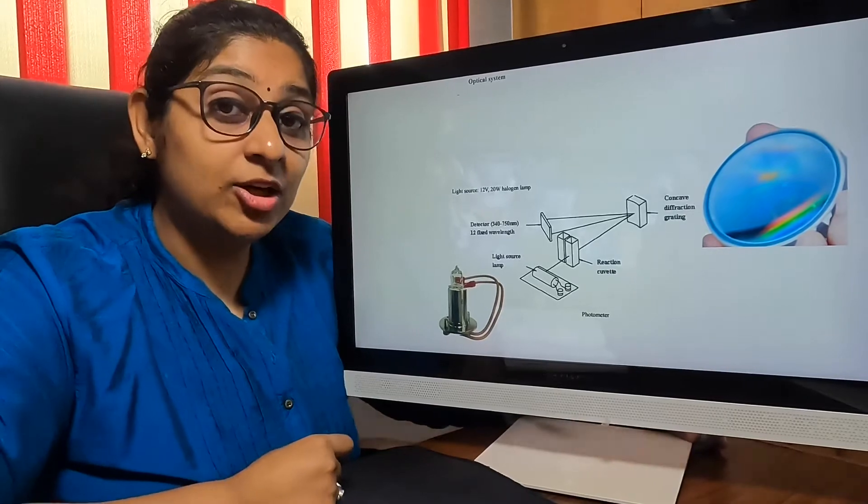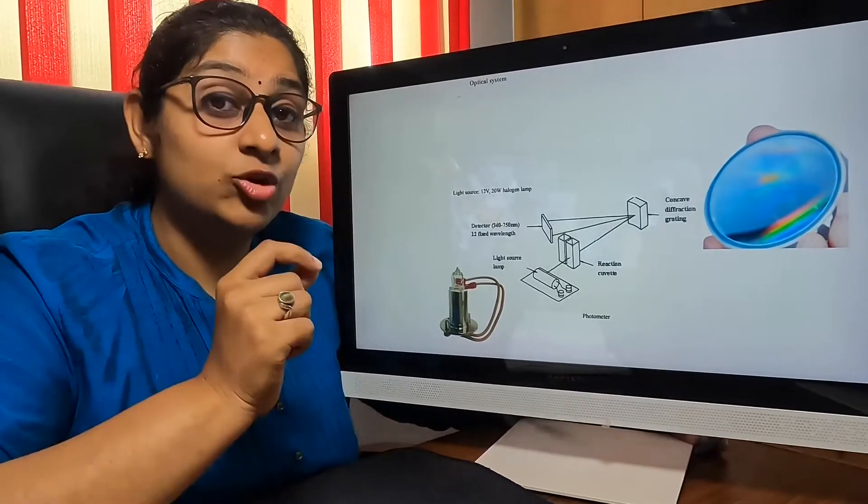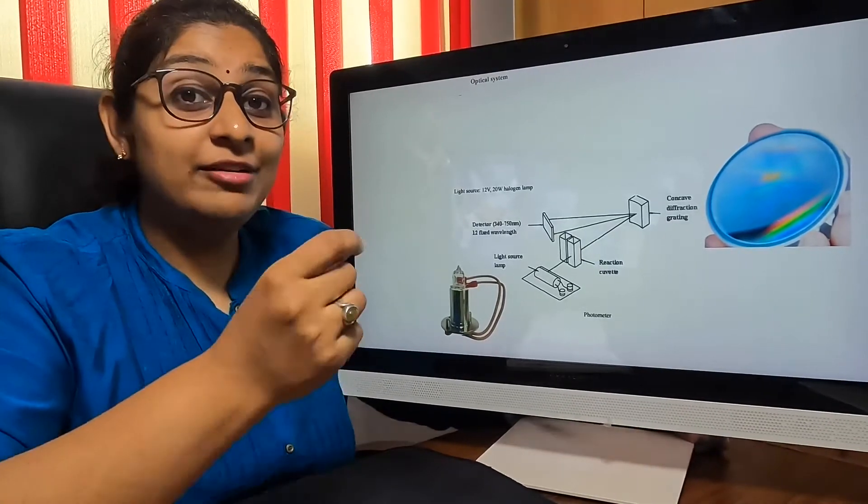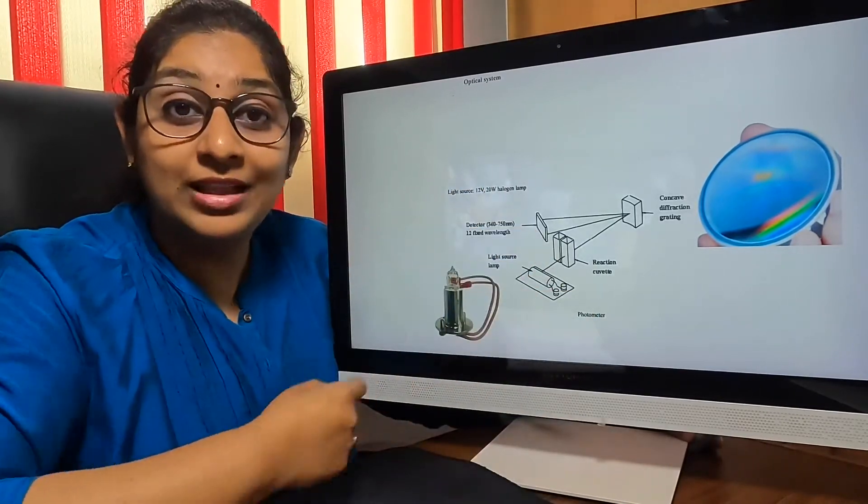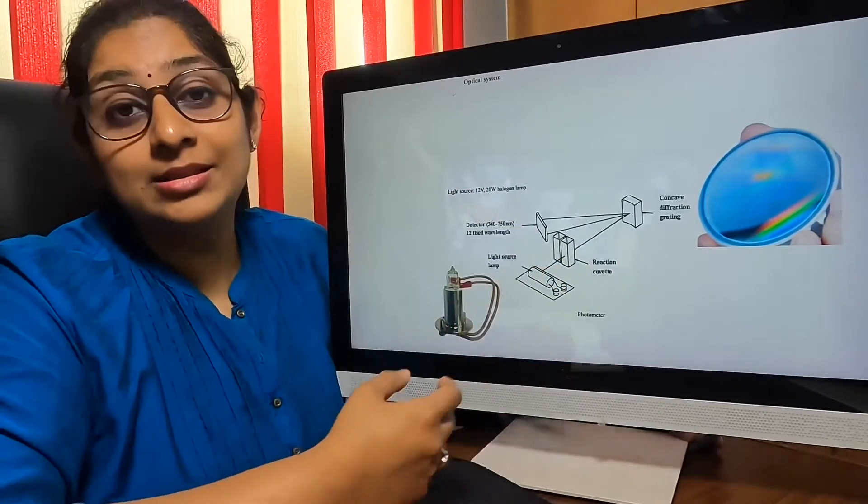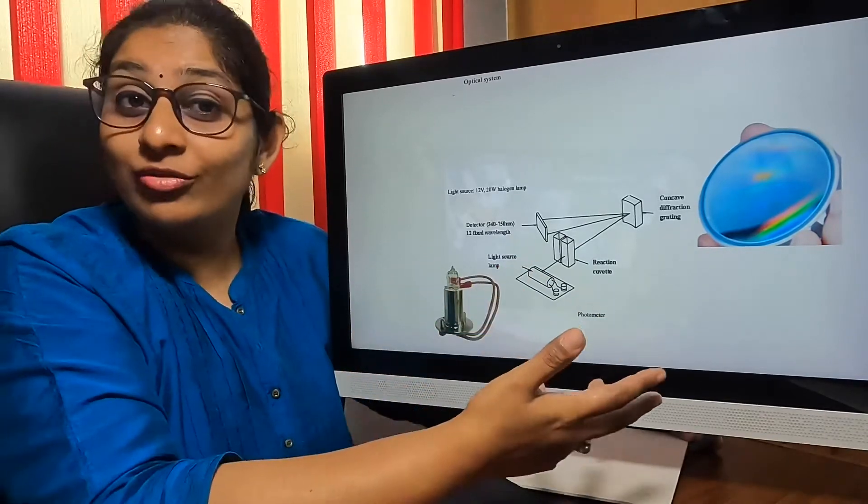This Durabi system has particularly 12 detectors at 12 various wavelengths. The wavelength starts from 340 nanometers and up to 750, there are 12 detectors. It goes like 340, 380, 405, 450.